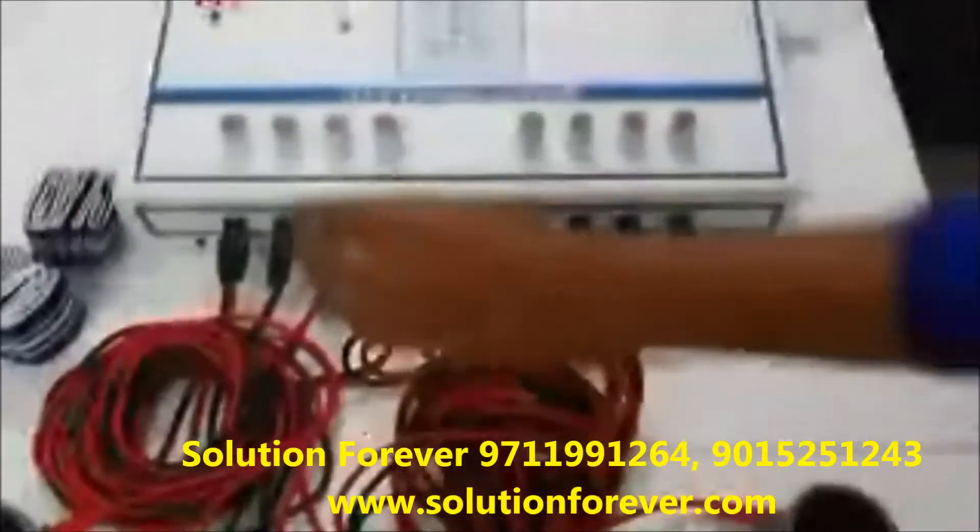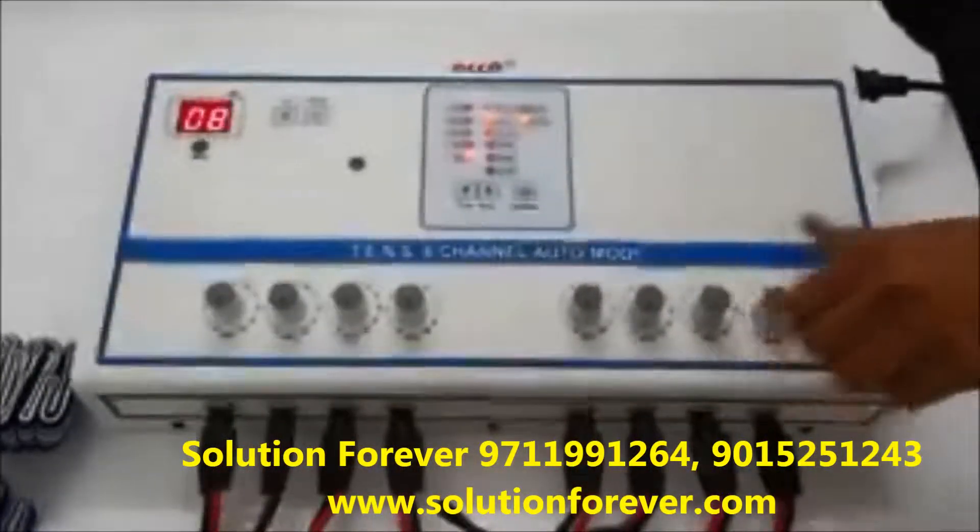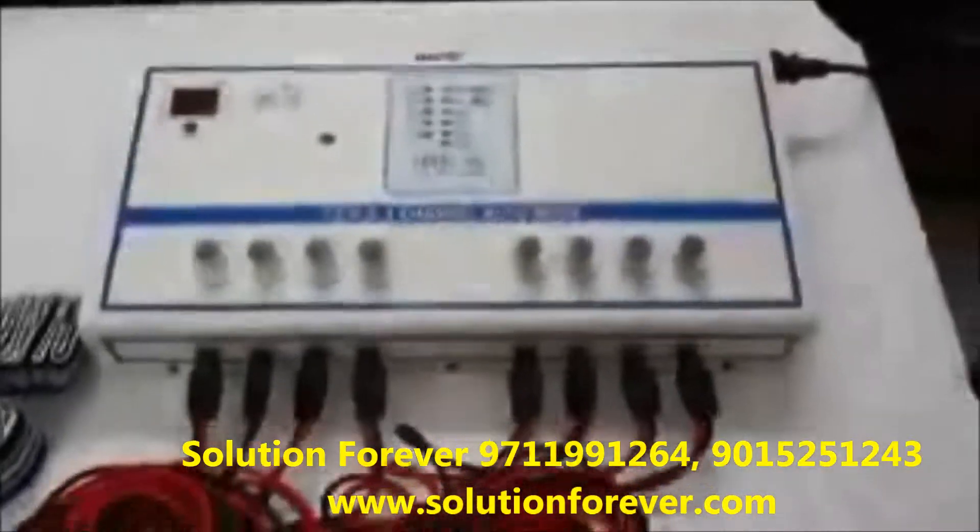After treatment is completed, return all intensity knobs to 0. Switch off the machine. The demo is completed.